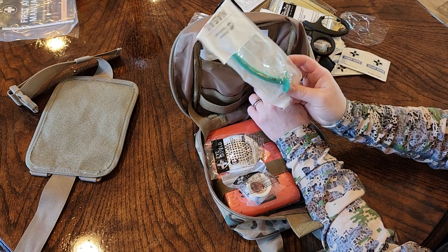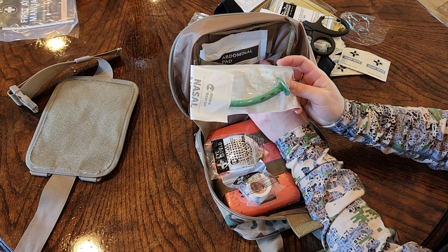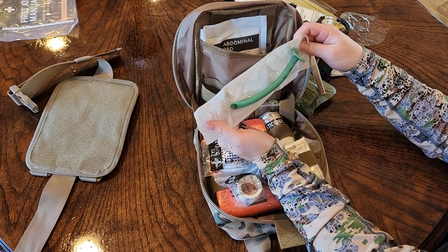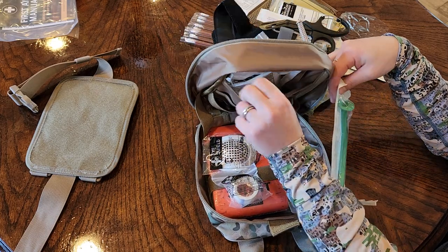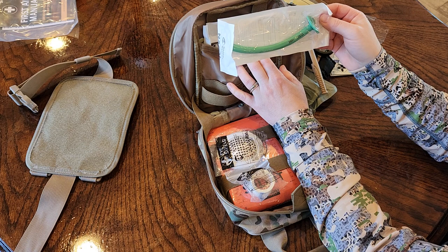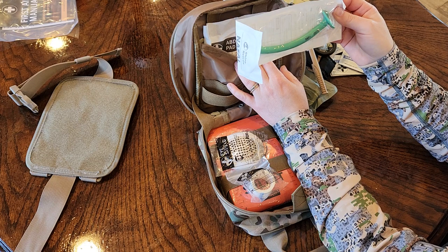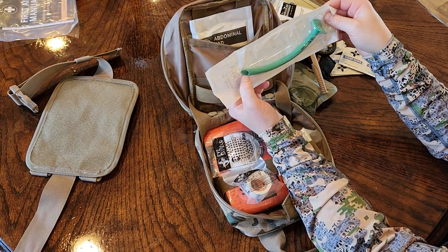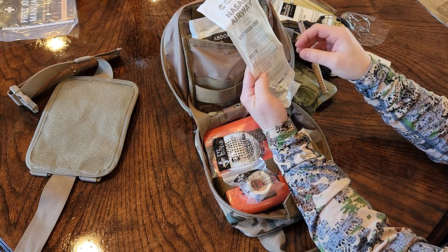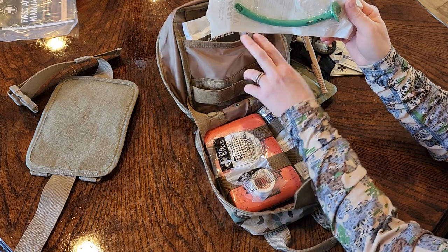All right, and then this is for your nose, your NPA. So if somebody's mouth is really destroyed and they're not breathing, you just lube this up if you can. Do they have lube? I didn't see lube. So you can use their own blood, or whatever's in their mouth, slap it around and then stick it in through the nose. This points towards your nostril and you stick it in, but you're supposed to measure and everything. Anyways, it's just another way to get air down to your lungs.